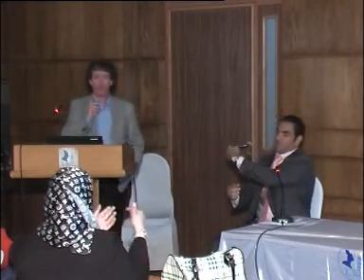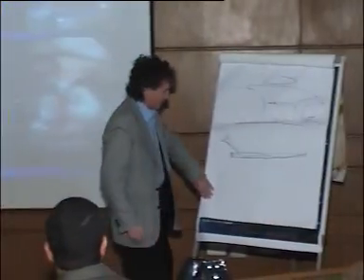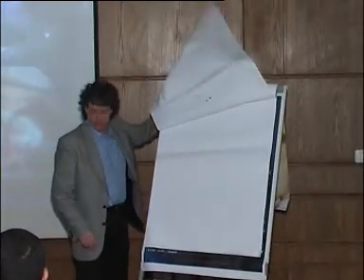The problem here, Dr. Philippe, and maybe I'm talking about other centers, is that we started in Cairo in '98, and I was one of the first people in Cairo to work with this. We have this false perception that if the CT shows massive effusion, it's safe, let's go in with thoracoscopy. This is a problem. You don't have to aspirate in this case. No aspiration. It comes spontaneously.